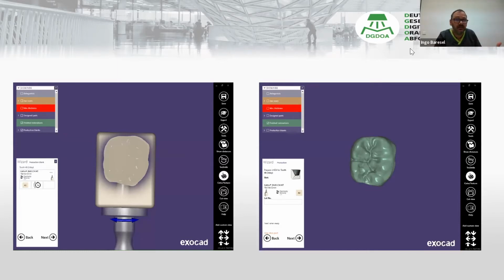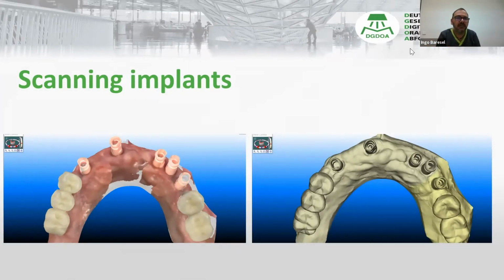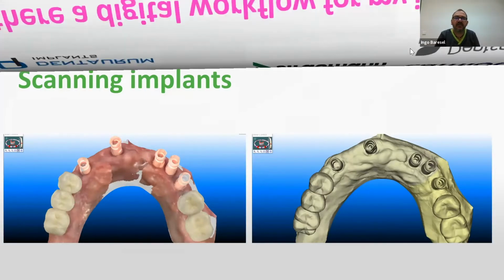You can do it, but you don't have to. You can even work on the left side. You can even scan implants. This is so helpful because it makes life so much easier for you than in the analog industry.